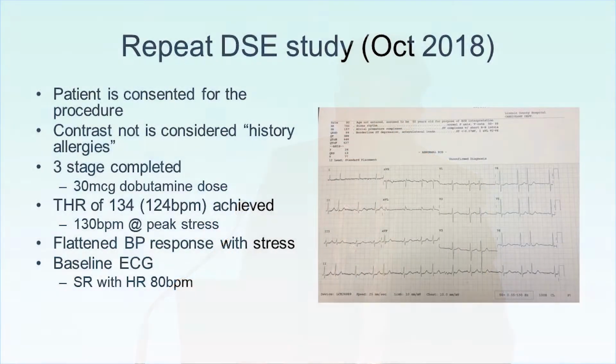Can't make your mind up there, so there's a choice between yes or no. So you're looking at, well, in fact, we actually repeated the DSE. So the question is that we go on to this patient, we consented for the procedure, and in October of last year, we, again, could not use contrast, but I just wanted to demonstrate it again, whether we were missing something.